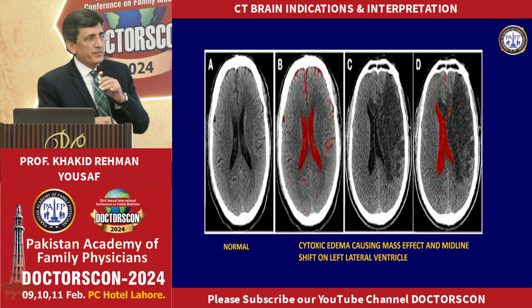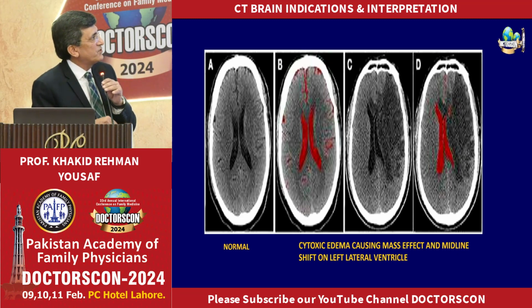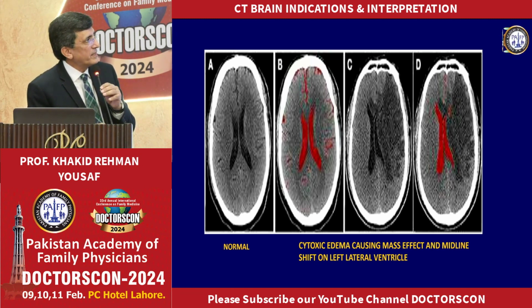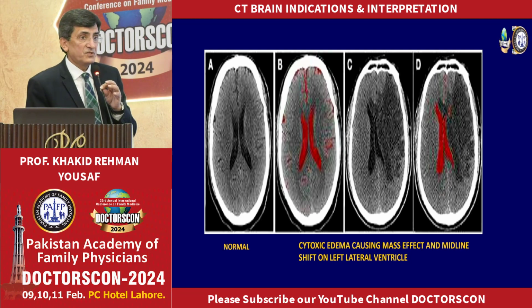This is one of the examples. This is a normal brain. We see the hypodense lateral ventricle, the normal brain, sulci-gyri pattern, and hyperdense bone. But over here you see a diffuse hypodensity on the left side of the brain. This is cytotoxic edema due to ischemic insult. This is not only edema, but it's also giving a lot of pressure on the ipsilateral ventricle, and there is a midline shift. This is of significance.